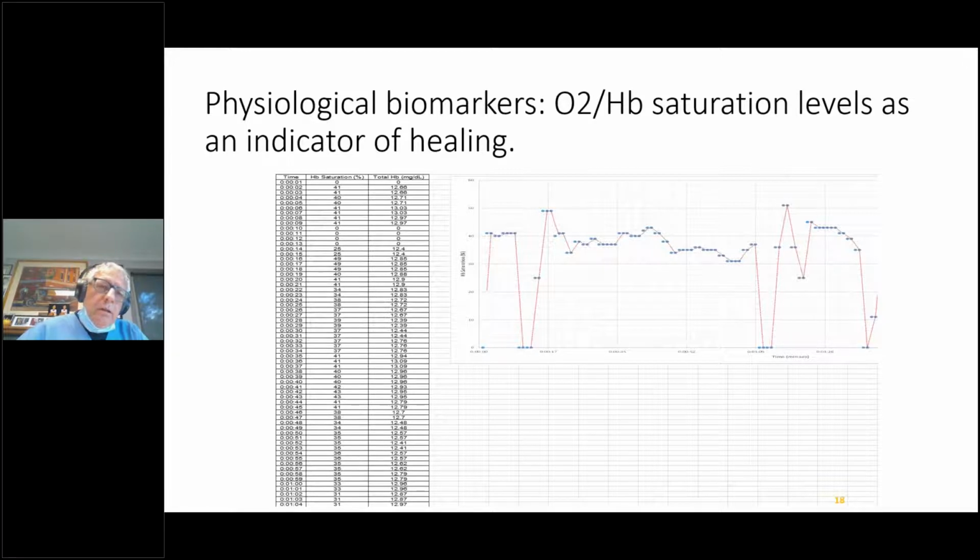Another rather novel outcome measure, I feel like I'm complimenting myself. It's not the way I mean to sound, but this is an outcome measure that is not commonly used for some of our rehab interventions. But I thought it was important because for so many devices that we get in, when we're asking the manufacturer, what's your value proposition? How does this work? They inevitably will talk about perfusion and saturation. So we happened to test some biosensor technology a few years back that would help us elucidate and better understand that. So we use biosensor technology now routinely to test out our devices.